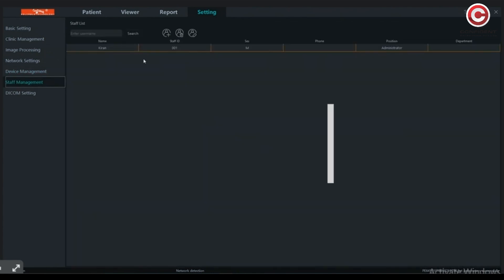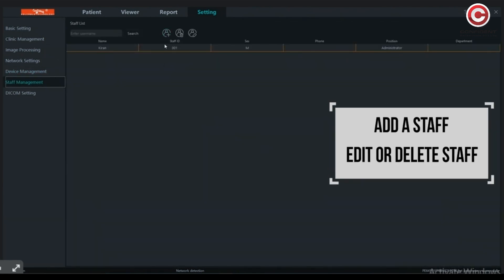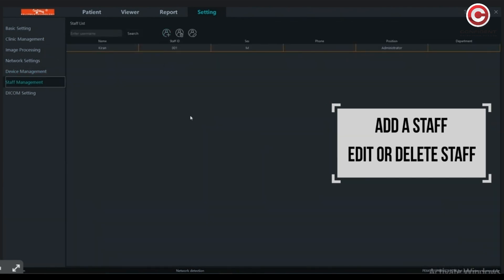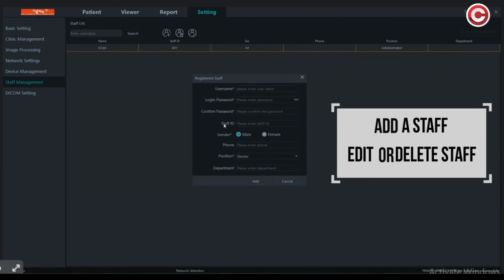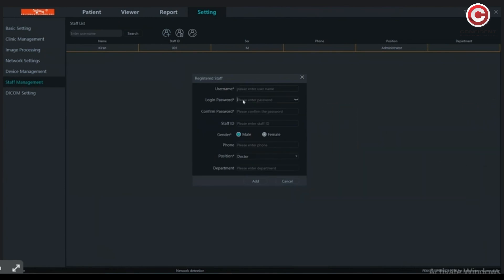Here you can manage the details of your staff. Add staff by entering all the required details. You can also delete or edit staff records.